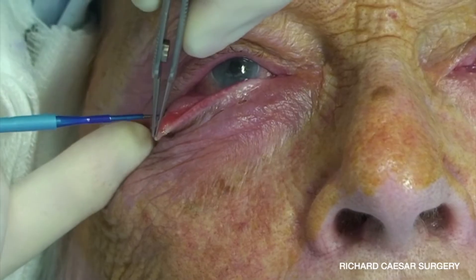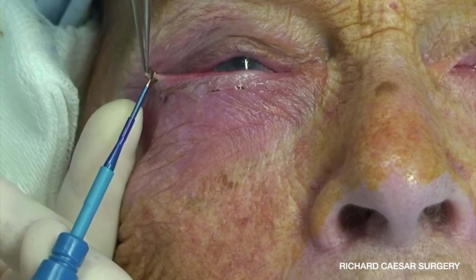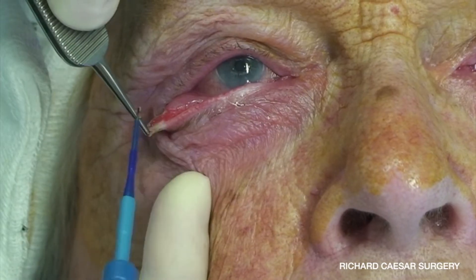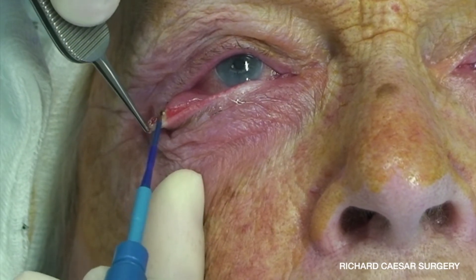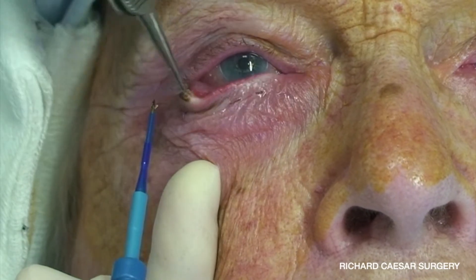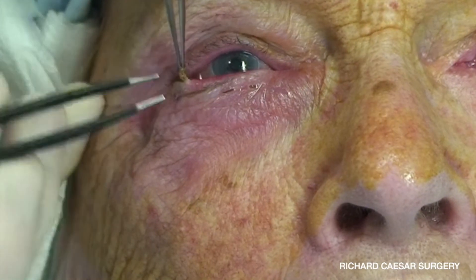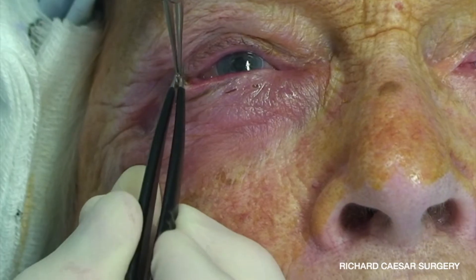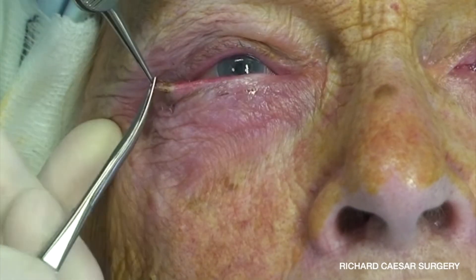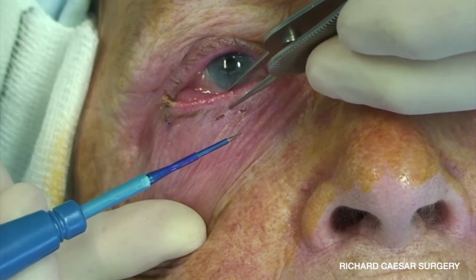I'm not always sure whether the absence of blood makes the tissues slightly less sticky afterwards — I think having a few fibroblasts around can be helpful. It's very important for the tarsal strip that the tissues are completely denuded, and it's absolutely vital that you also squeeze the meibomian orifices and empty out the meibomian secretions. Then the end piece is trimmed off, leaving you with a nice little tarsal strip.